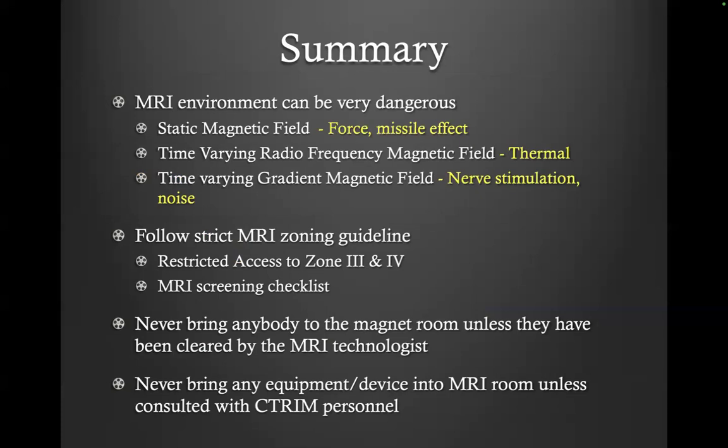Okay, in summary, the MRI environment can be very dangerous. You have the static magnetic field, which has force and a missile effect. You have the time-varying radio frequency magnetic field, which can have a thermal effect. And you have the time-varying gradient magnetic field. You have nerve stimulations or noises.